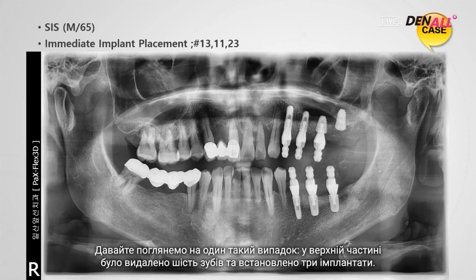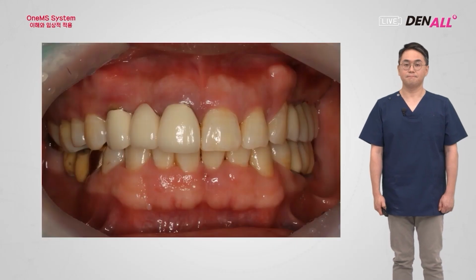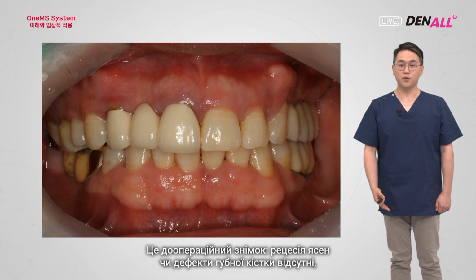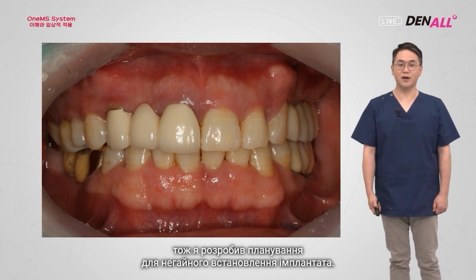On the upper part, 6 teeth were extracted and 3 implants were placed. But due to periodontal disease, there was mobility, and on the right upper side, the prostheses were also shaky. This is the pre-surgery photo. Gingival recession or labial bone defect did not exist, so I planned for immediate implant placement.